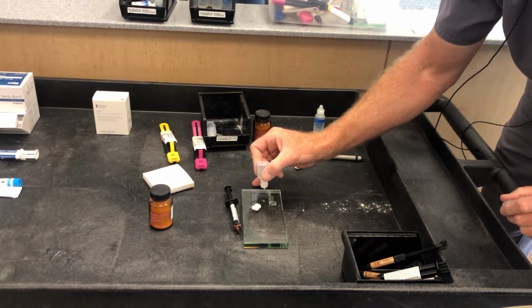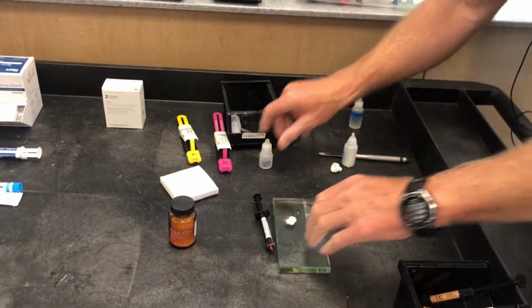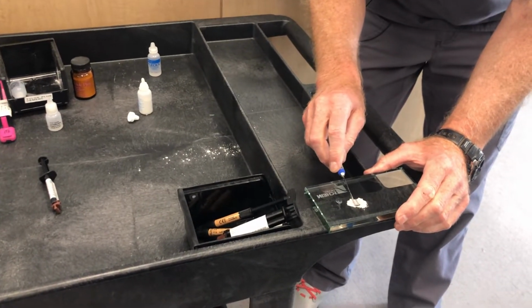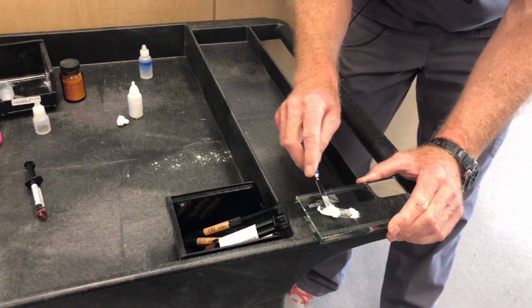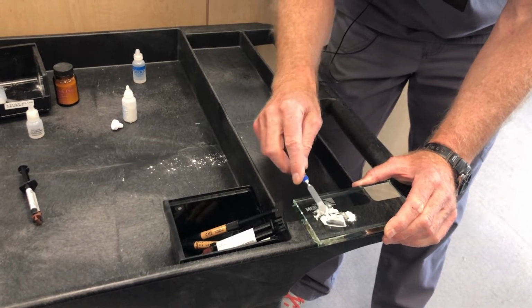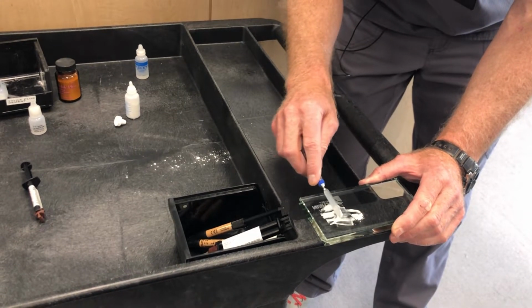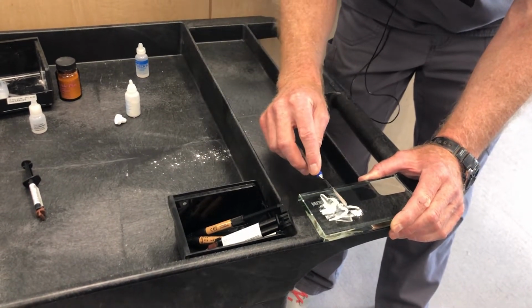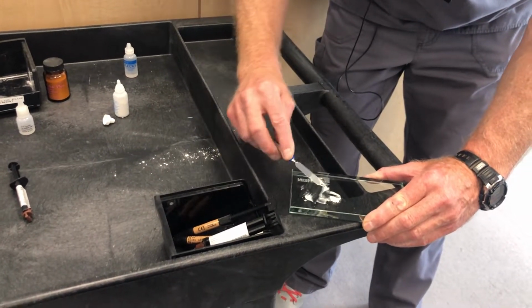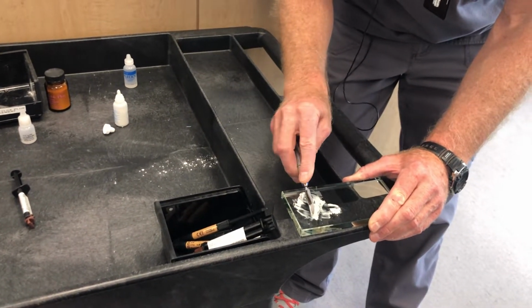So, invert your bottle, 2 or 3 drops of water, depending upon how much you want. And then you'll mix this by just bringing the powder into the liquid. Again, this one it's not real critical how it's mixed in terms of proportions. And you don't want to mix this on a paper mixing pad like we have, because what does the paper do? Even though it's got a glossy side to it, the paper soaks up all the moisture, and so these dry out on you.